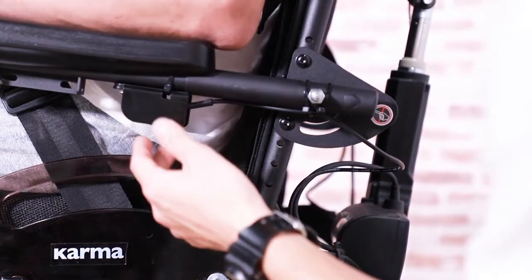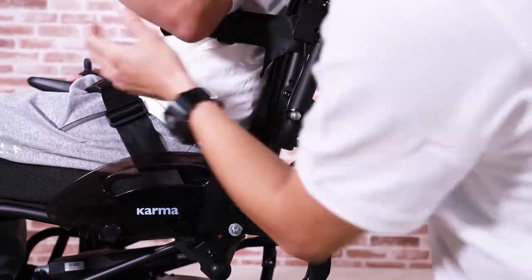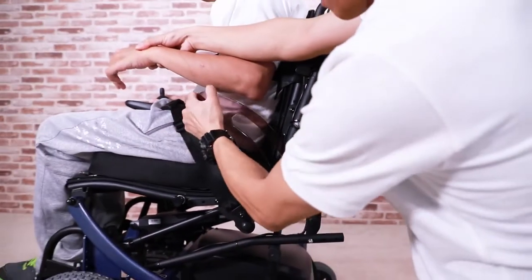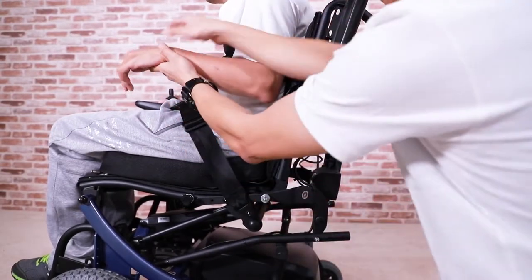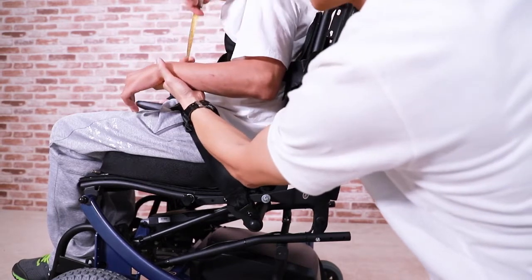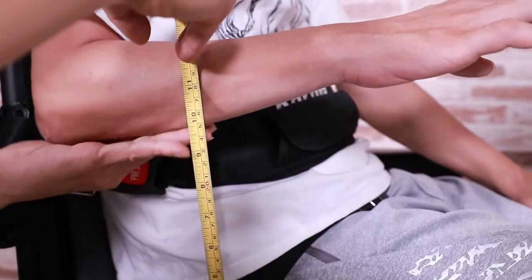Now, how do we determine the correct armrest height? Firstly, we flip back the armrest. Let the user position his arm comfortably. Measure the length between the seat frame to the arm. Help him into the position. See, it is roughly 26 centimeters.